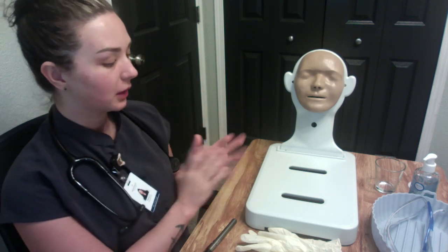Hi, my name is Hunter, and today I will be performing the skill of inserting an NG tube. I'm in school appropriate scrubs, and I have my badge here, and my patient. So, the first thing we want to do is gather our supplies.